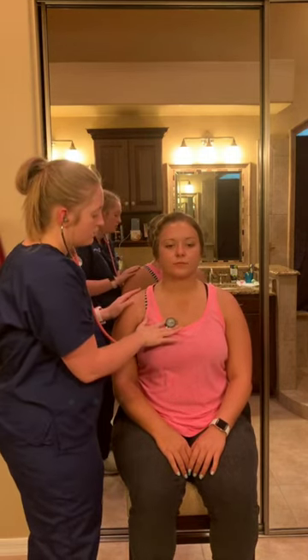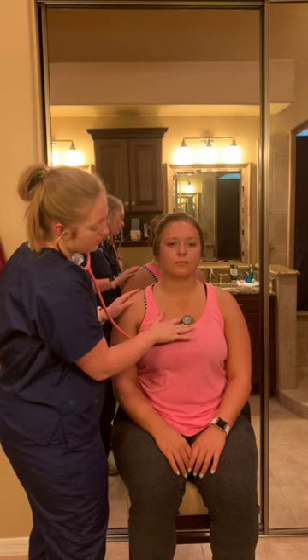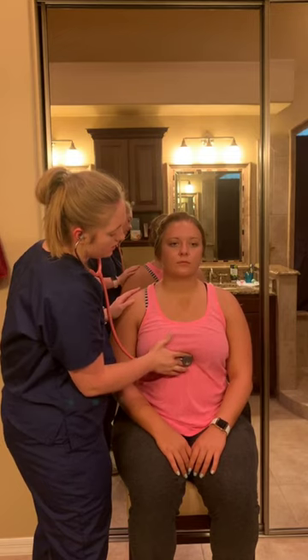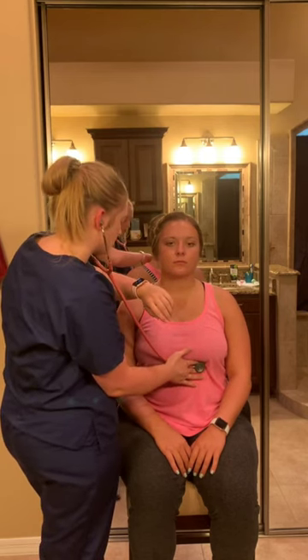I'm going to take my stethoscope and listen to the heart. I'm going to begin by listening to the aortic valve, then move to the pulmonic valve, then Erb's point, then the tricuspid, and then the apex at the mitral valve. I'm going to listen here for a full 60 seconds to count the apical pulse.